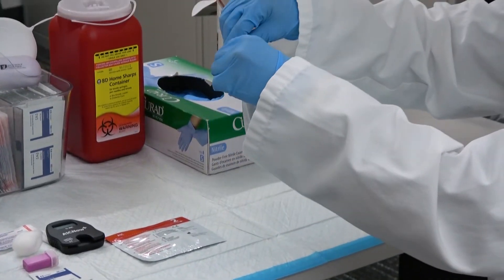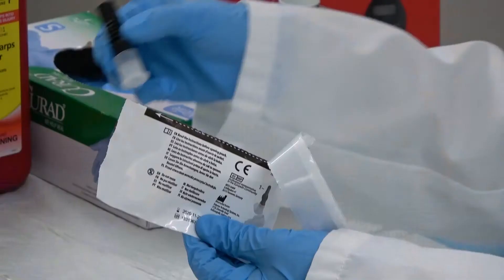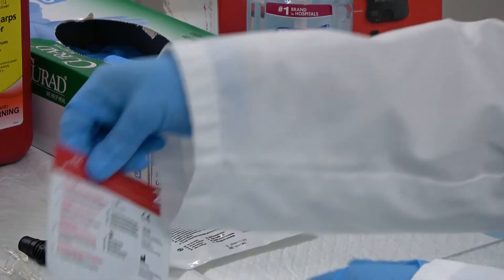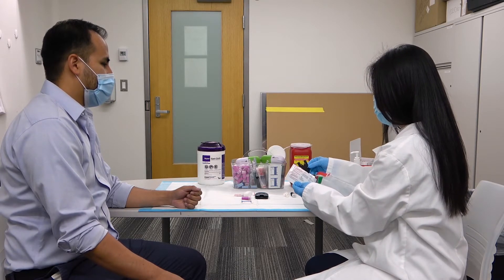Open package 1 and remove the capillary tube and sample dilution kit. Open package 2 and remove the testing cartridge.